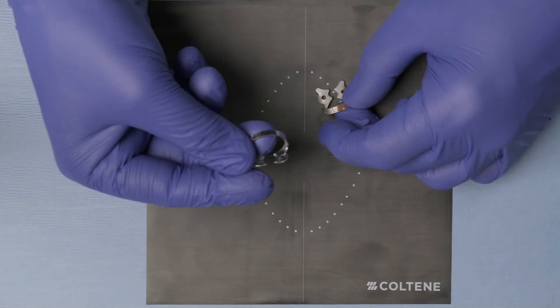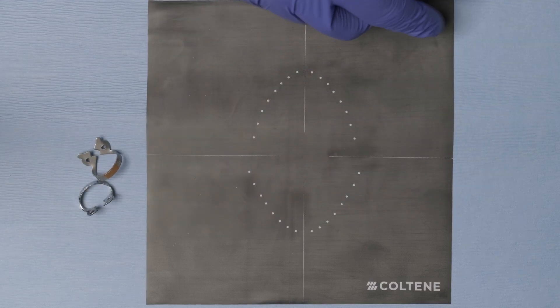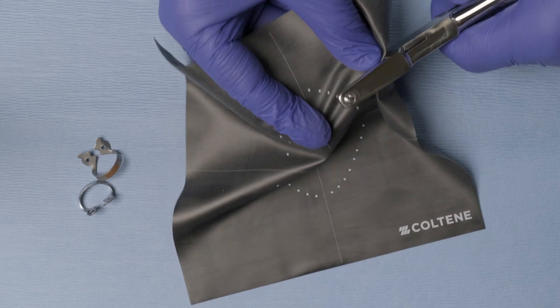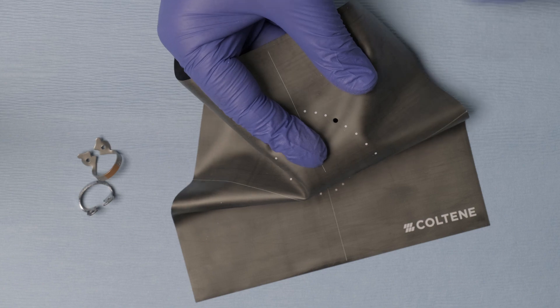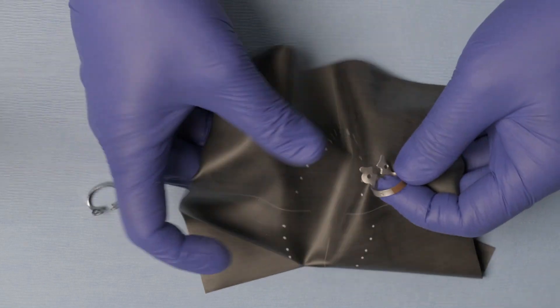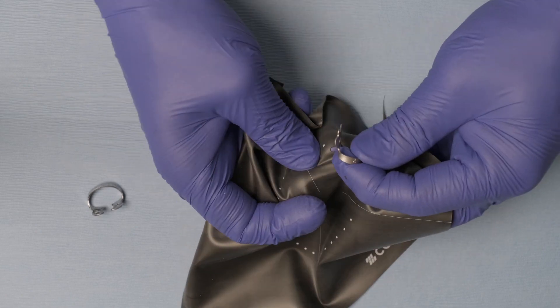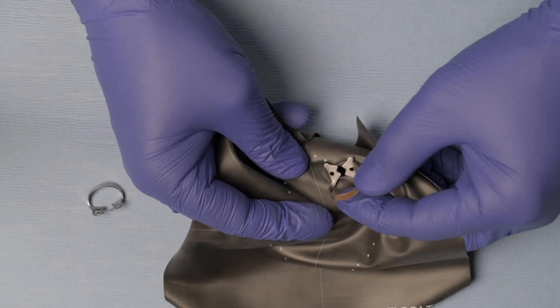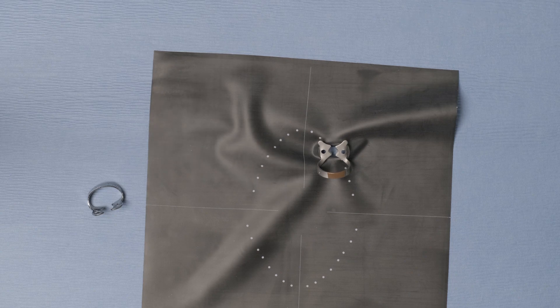I'm going to show you how to do the same thing with a wingless clamp. First, I'm going to perforate my isolate black rubber dam. Once the rubber dam is perforated, I'm going to attach the two clamps — just to review this. You're going to grab the wings of the clamp and stretch them until you connect it to the rubber dam. That's how easy it is when you are using a wing clamp.